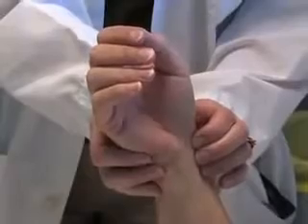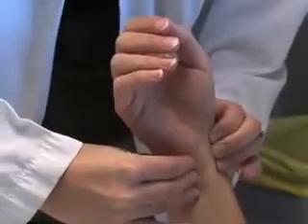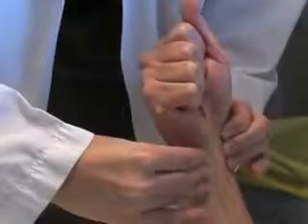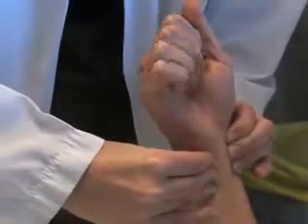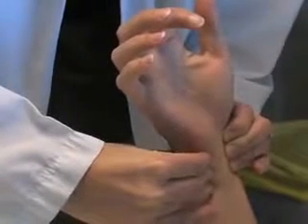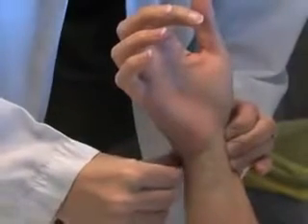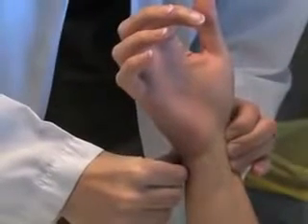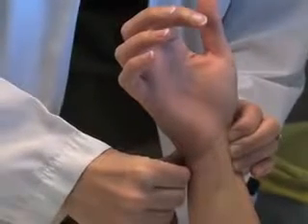To perform the Allen test, occlude both the ulnar and radial arteries. Instruct the patient to make a fist to drain the blood from the hand. This should be done for approximately 30 seconds. Instruct the patient to unclench the fist. The patient's palm should appear blanched or pale. Now release pressure only from the ulnar artery. Adequate collateral circulation is indicated by the return of normal color within 10 seconds.